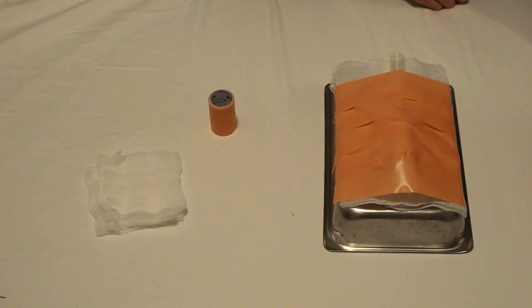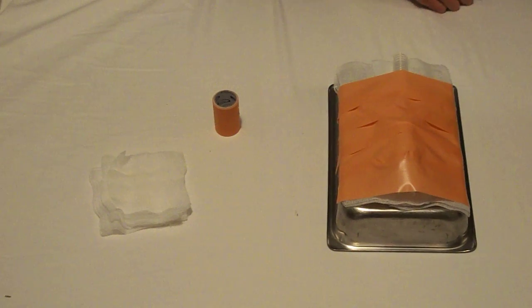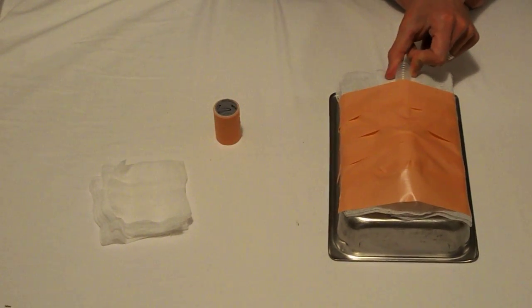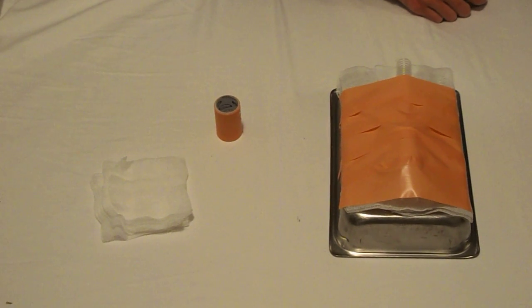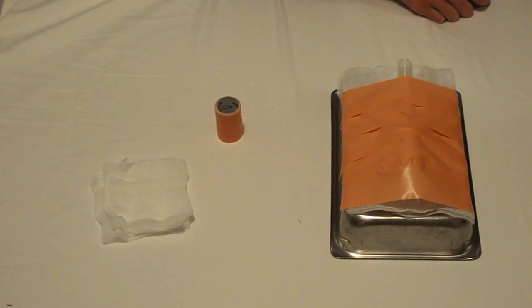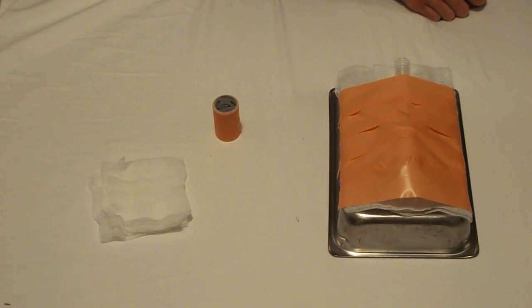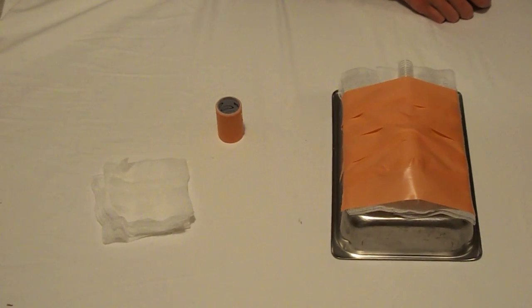Now, using equipment that you'd normally use for a cric, you can practice your cric skills. You'll notice that you can just rotate the trachea tubing and create more portals for tracheas so that you can practice several times on one piece and then you can replace the tubing and practice more.